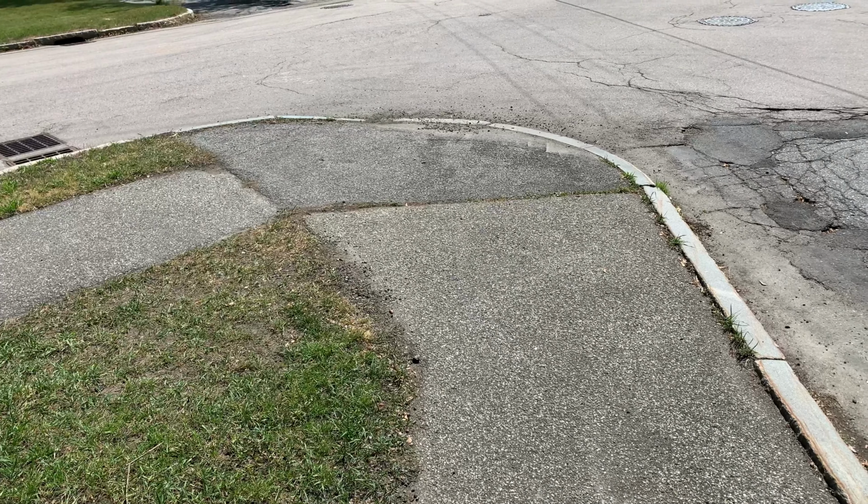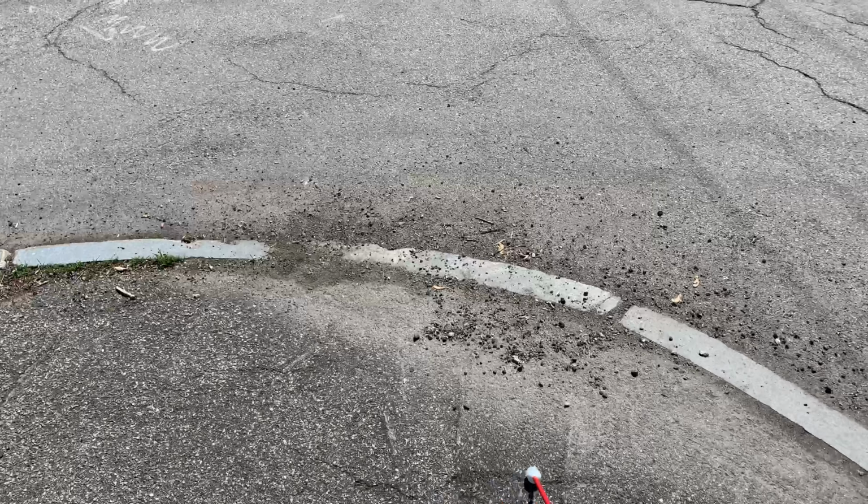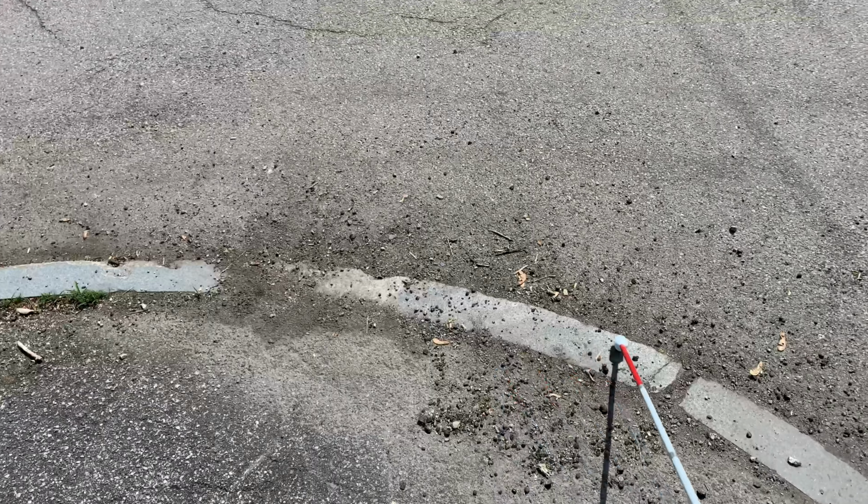So let's try that. So I'm doing constant contact again, and I'm walking towards the corner. I feel the slope down with my feet. My cane is going down, and I could feel a little bit the difference between the curb and the street and the sidewalk. So that's one way of knowing you have located a corner.